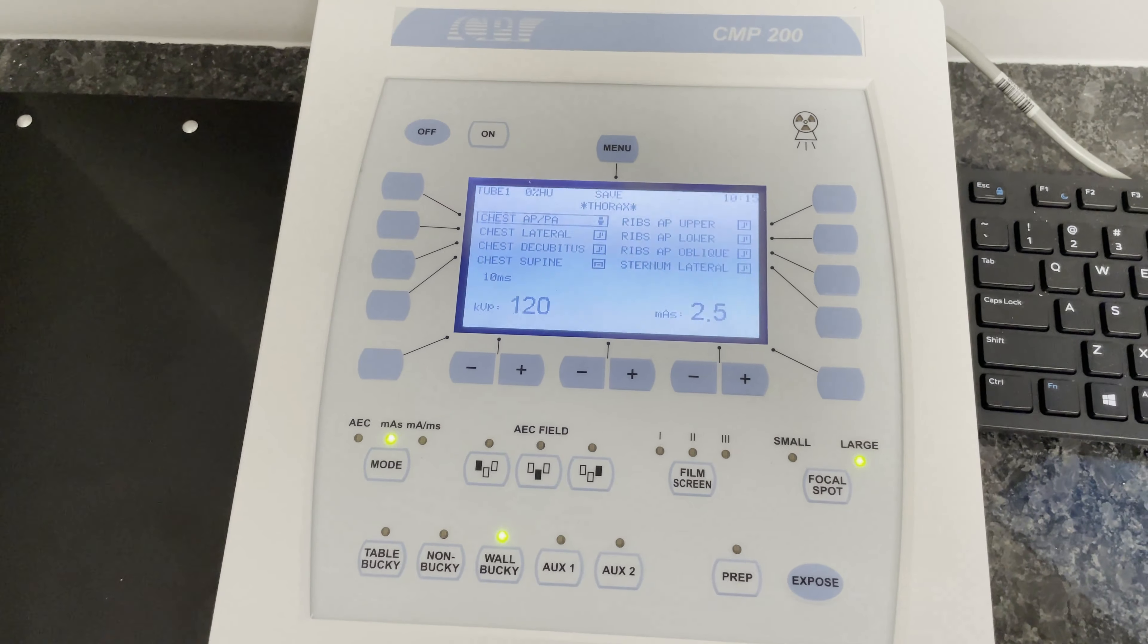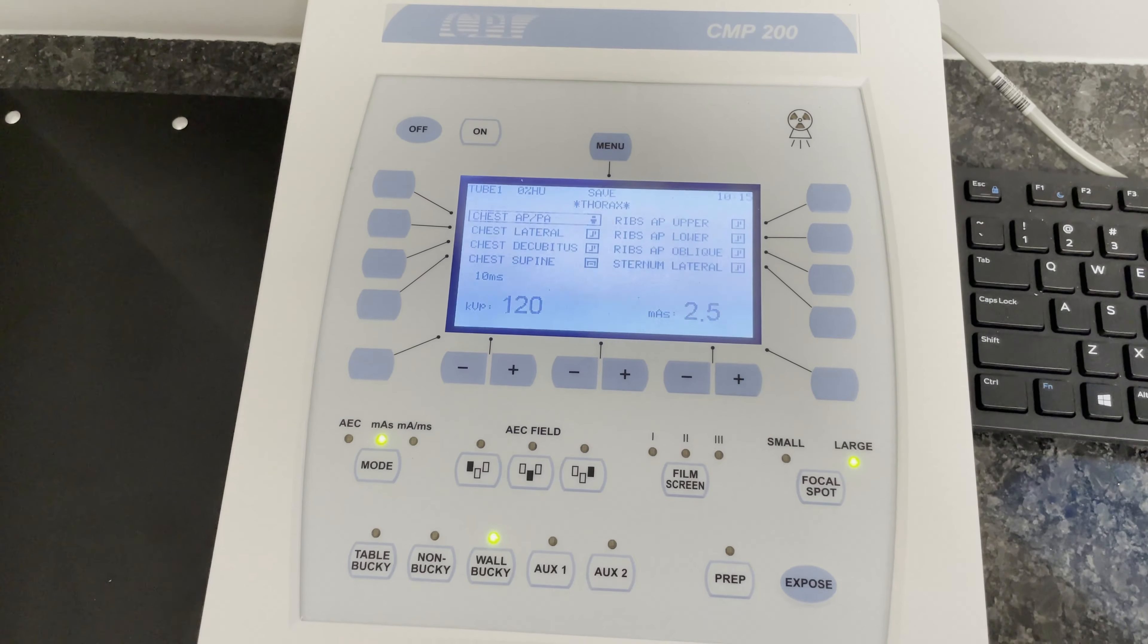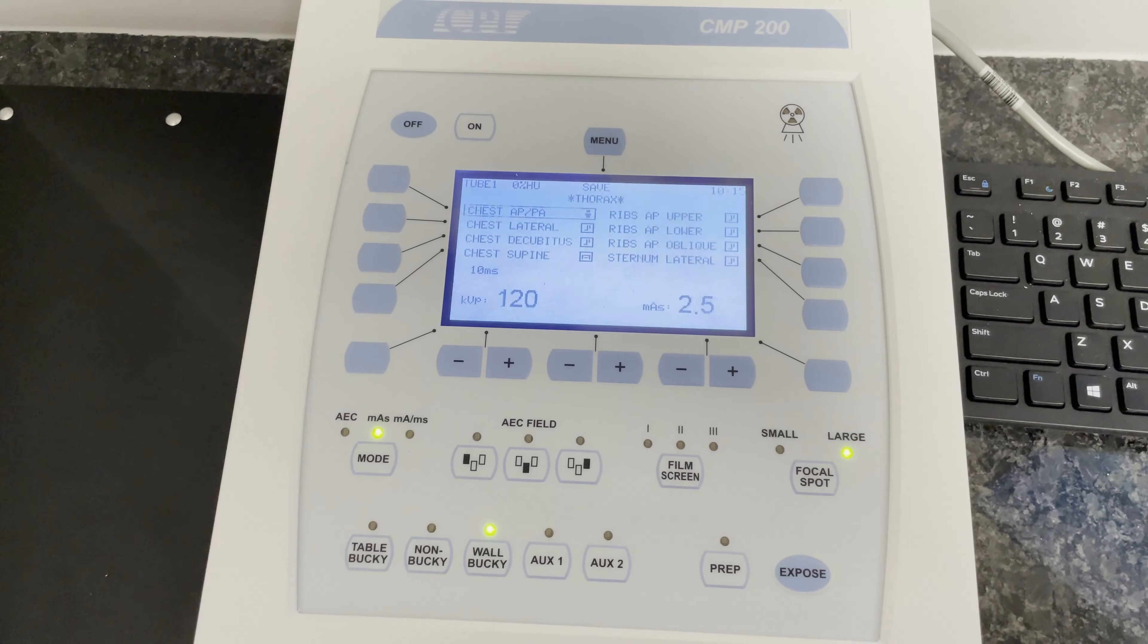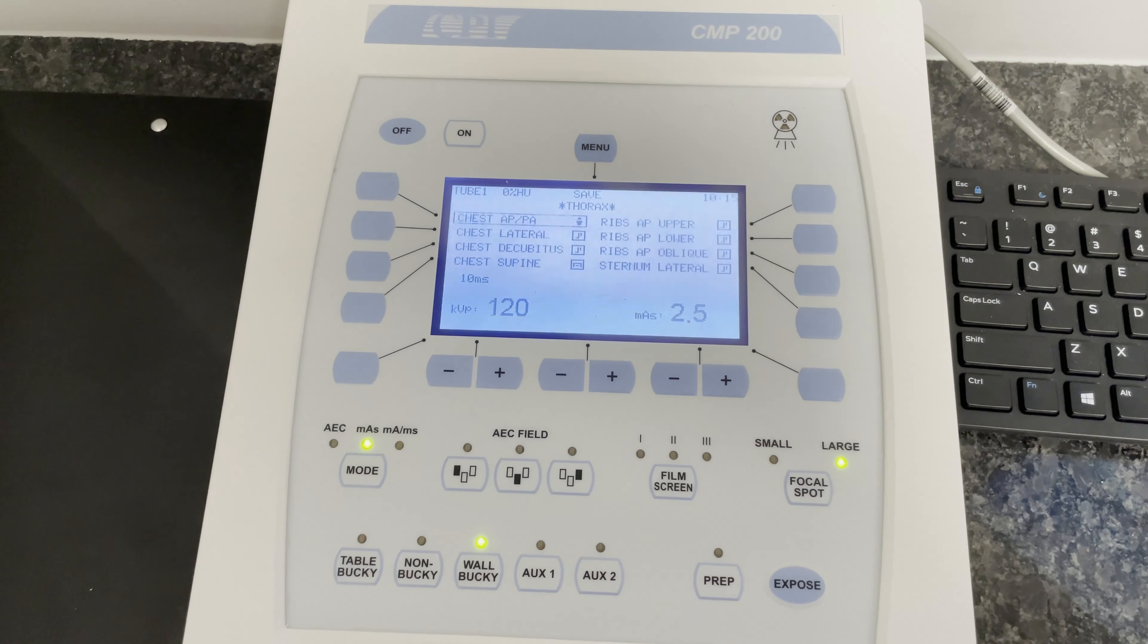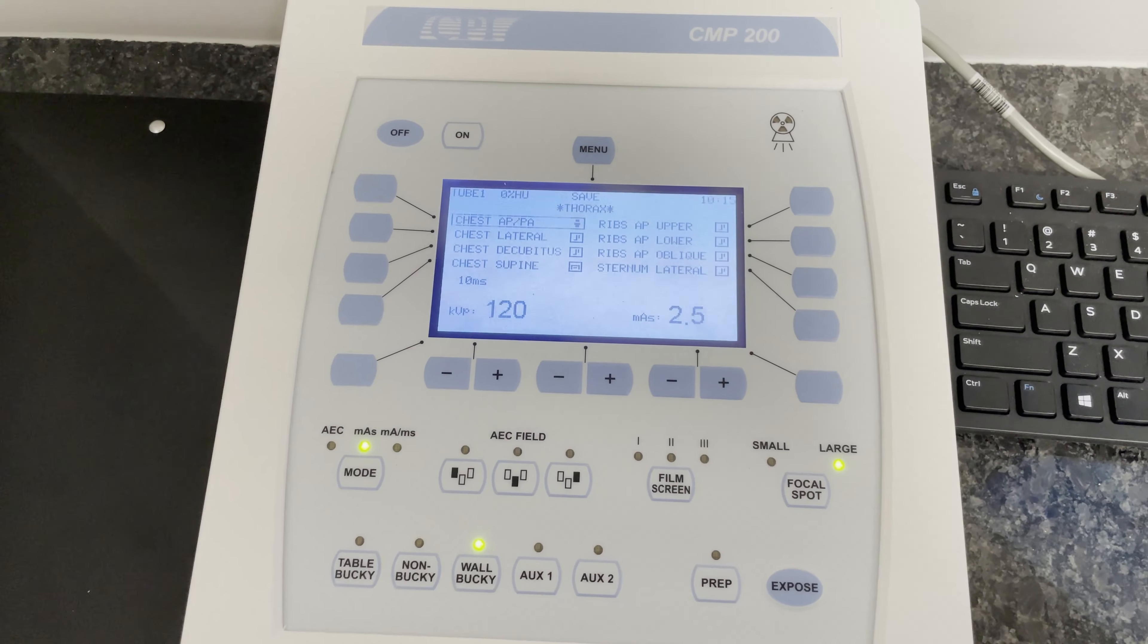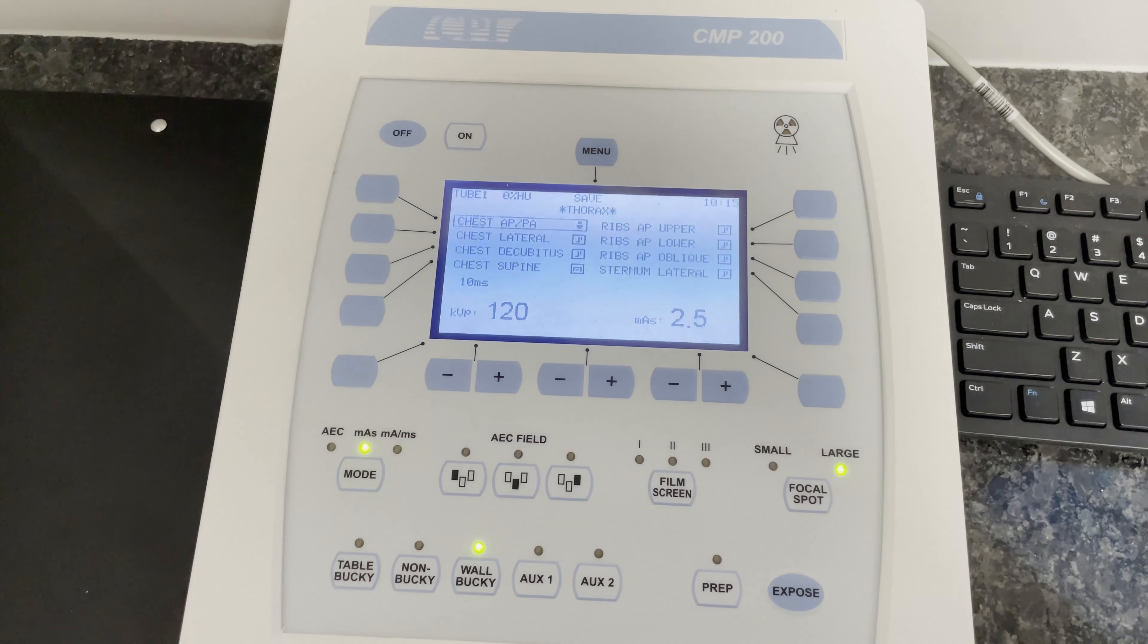At that point, the x-ray will be taken and you'll be able to see the digital image on the software within five to eight seconds.